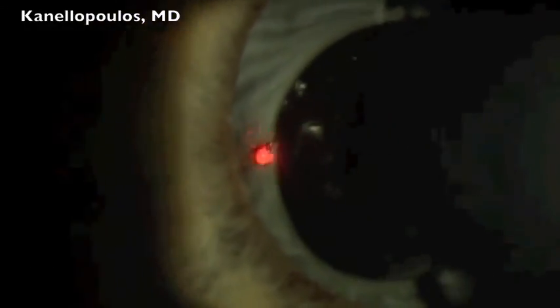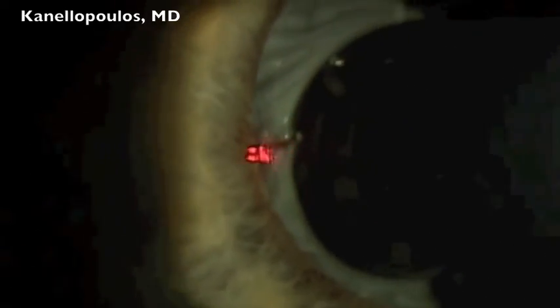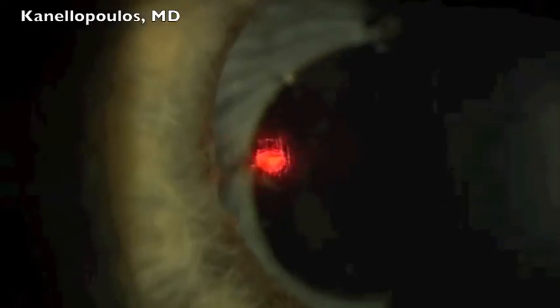Again, this was a very high myopic patient, which is why she originally sought to have a phakic intraocular lens. The problem with that original surgery done elsewhere was that they placed an anterior chamber lens in a very shallow chamber, which at some point caused corneal decompensation.